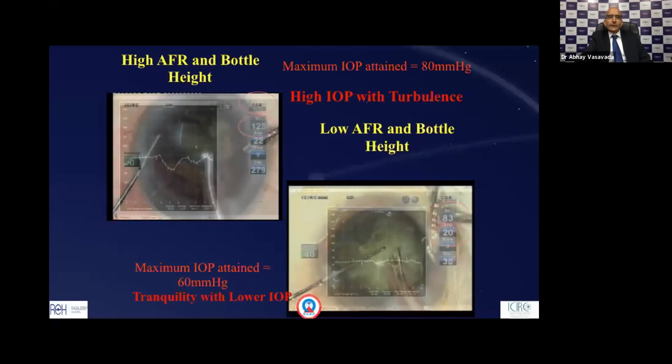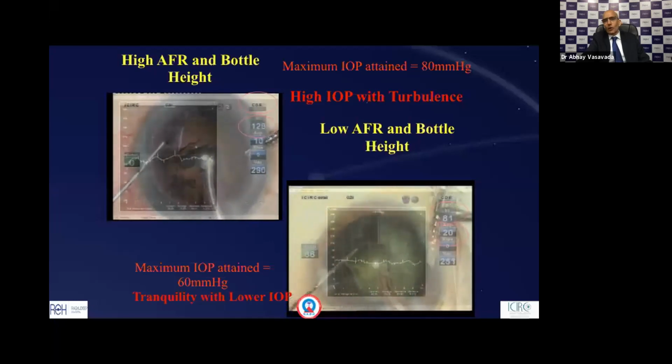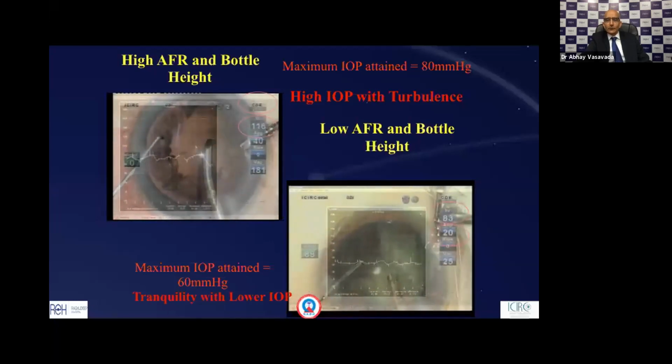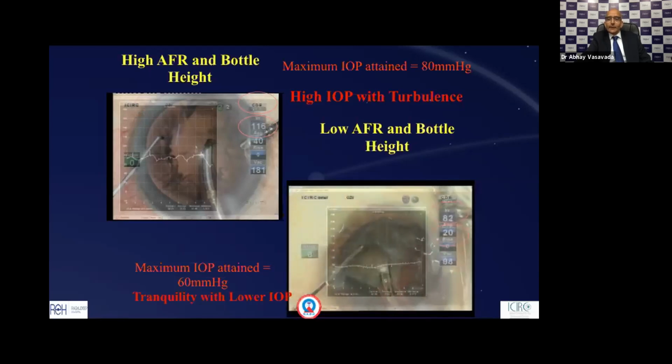So in the good old days, the technique like slow motion technique, which used very low bottle height and flow rate, didn't work well because it took a long time. It was very tedious for the surgeon. But with the torsional ultrasound, because the material remains at the tip, these lower flow rates could compensate for the lack of speed. So the efficiency or the speed was not compromised, and still we could remove the fragments and the lens away from the cornea. So safety was added by this torsional component, and therefore lower parameters now are the in thing.